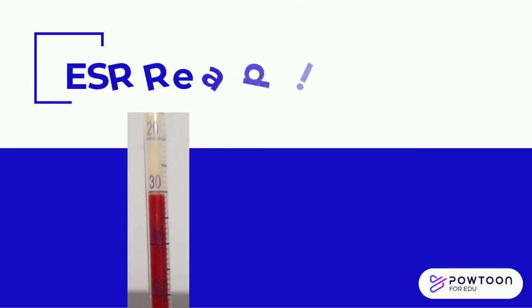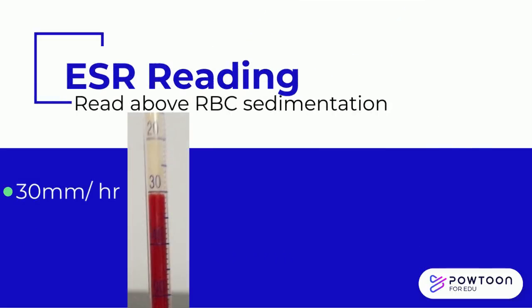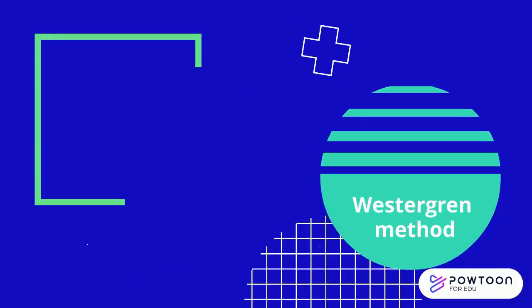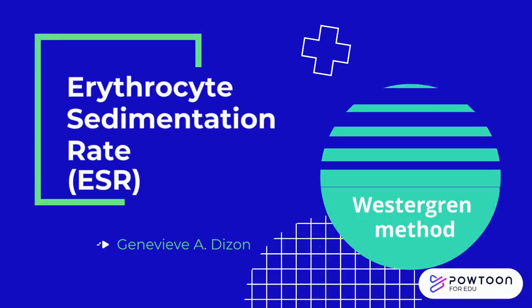The reading for this tube is 30 millimeters per hour, and this tube gives a reading of 52 millimeters per hour. That ends our discussion about the Westergren method. Thank you for listening.